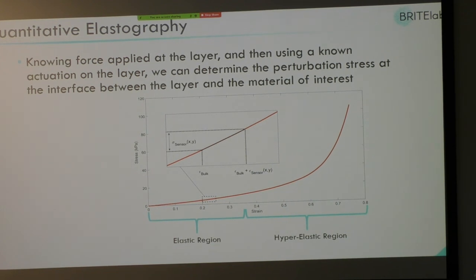So we partly answered our question at the end about the depth of the tumor. Which level of confidence can you detect the tumor? Because this is just margin assessment, the idea is to take the image after the bulk of the tumor has been removed, and you're just checking around the cavity to see if there is still tumor there.